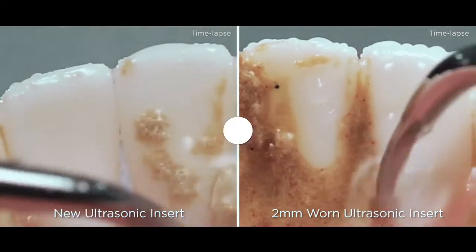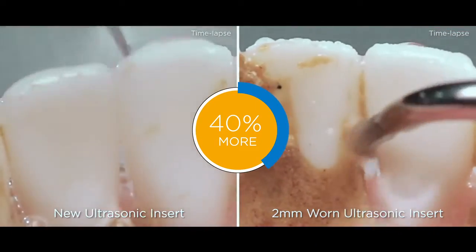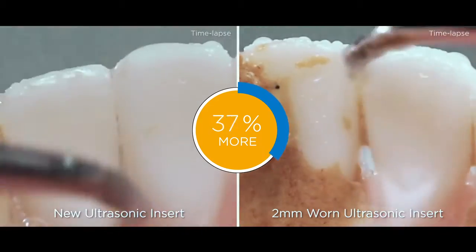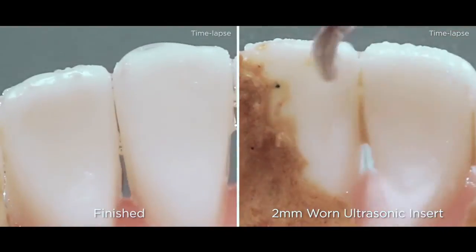In addition, a clinician will use 40% more scaling force over the course of the procedure. This may result in an increase in both patient chair time and pressure used by the clinician while scaling.